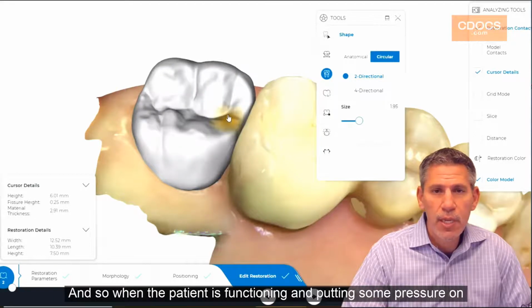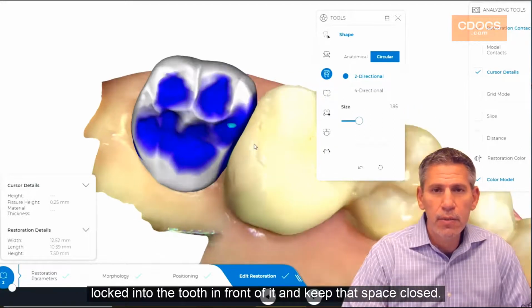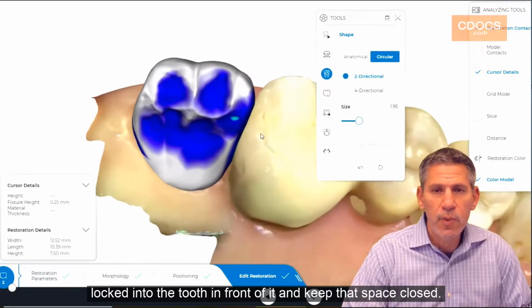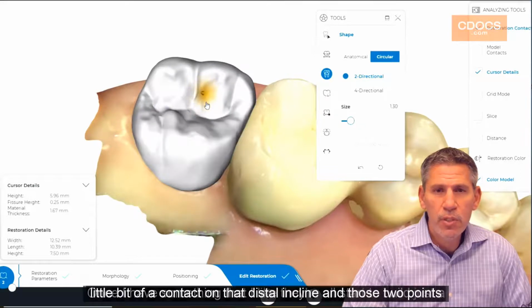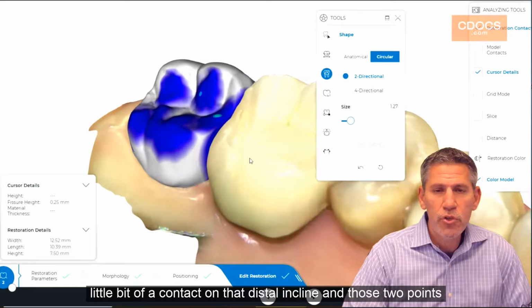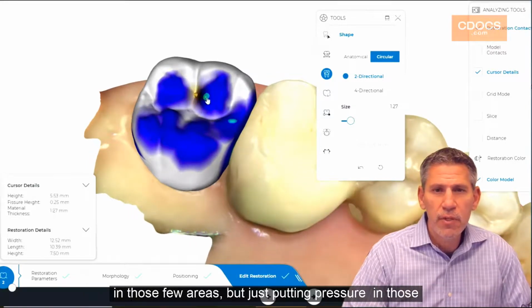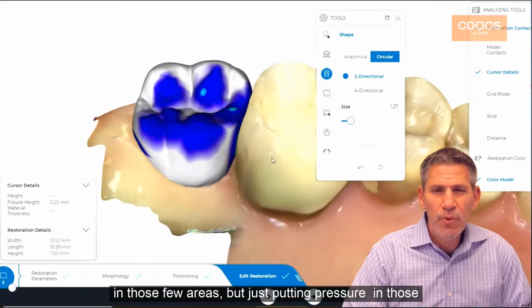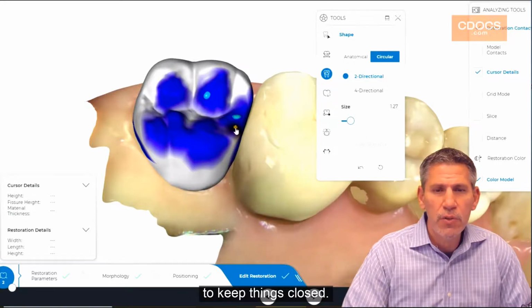And so when the patient is functioning and putting some pressure on that mesial marginal ridge, it's going to want to really keep that tooth locked into the tooth in front of it and keep that space closed. Once I have something that I like there, I'll start to build just a little bit of a contact on that distal incline. And we can increase the strength just a little bit in those few areas, but just putting pressure in those 2 points is really going to make a big difference, and it's going to go a long way to keep things closed.